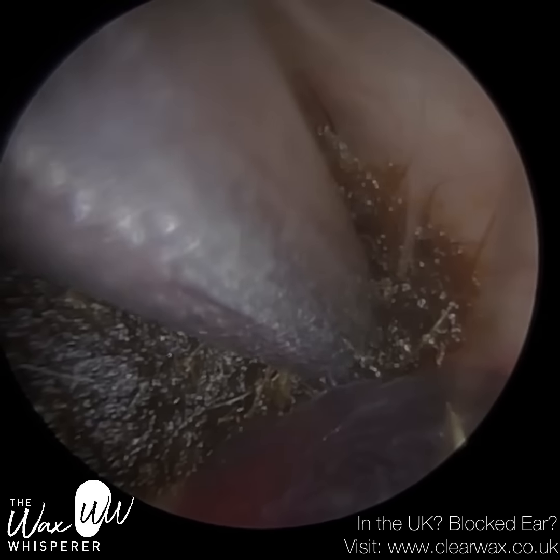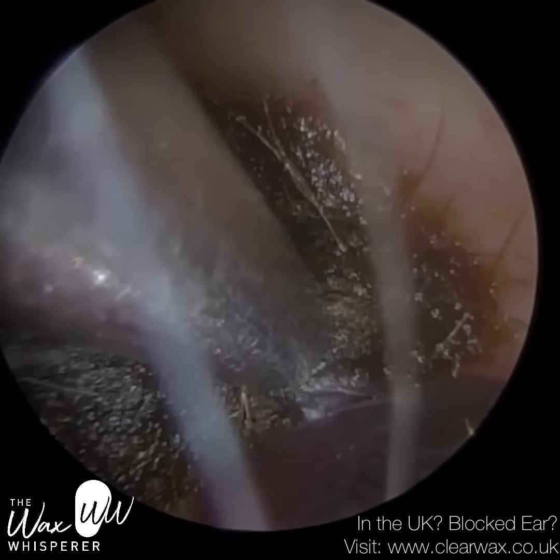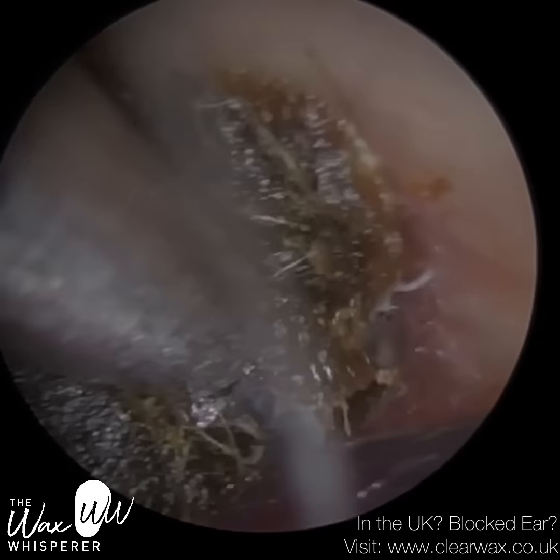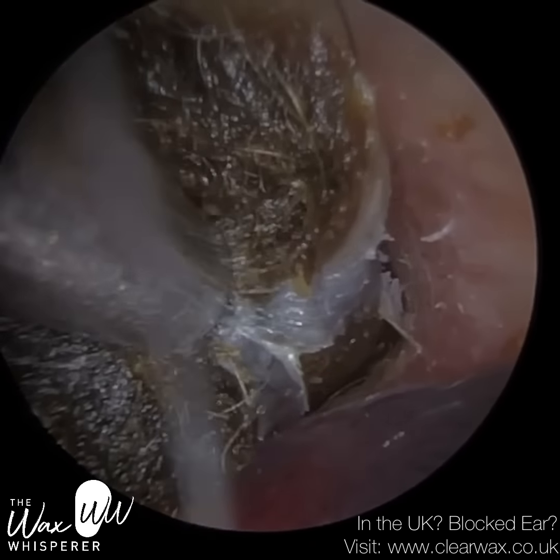I'm just using microsuction, trying to detach this wax off the back part of the ear canal. And I'm going to use the suction probe all the way around the perimeter.